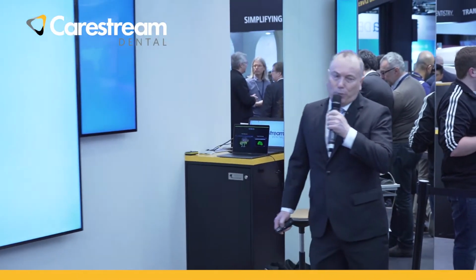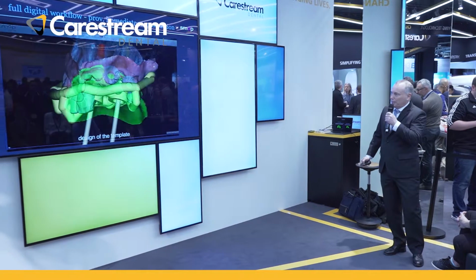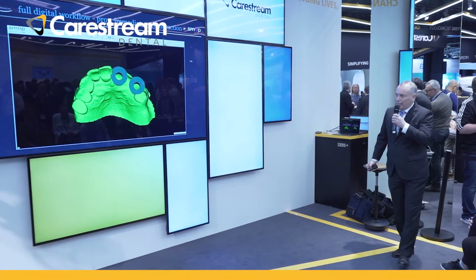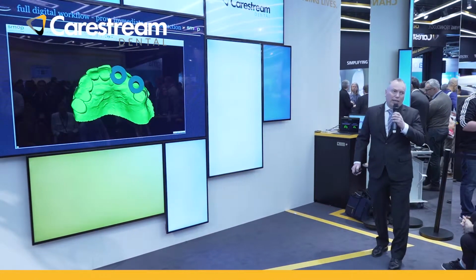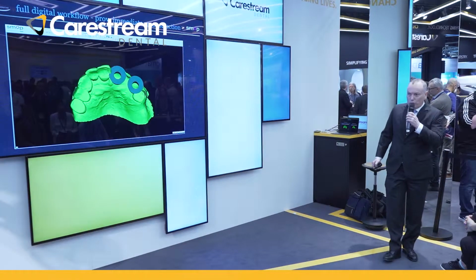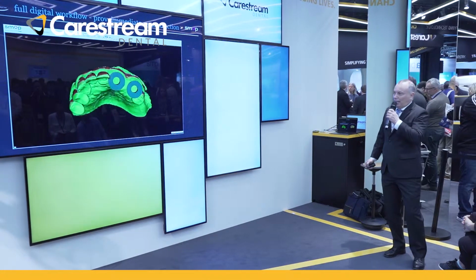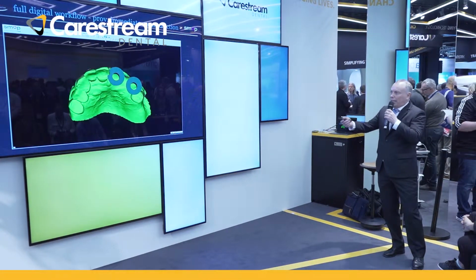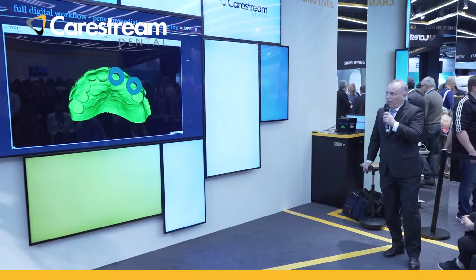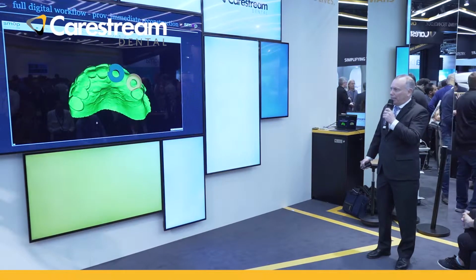The next step was to design the template. Here I show you the design of the template. You can do this through a service center, or the surgeon can do it himself. It's in real time here, so you see how little time it takes me to plan this template.